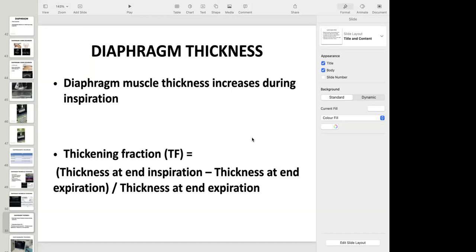So I find this is really an underutilized tool, both inpatient and outpatient in the pulmonary world. It helps me differentiate when I'm presented with a patient with shortness of breath in the acute setting, particularly post-operatively, like you see. You might see a unilateral diaphragmatic paralysis, or if it's more chronic, a unilateral diaphragm that has been denervated long enough that it's thinned and does not thicken any longer.